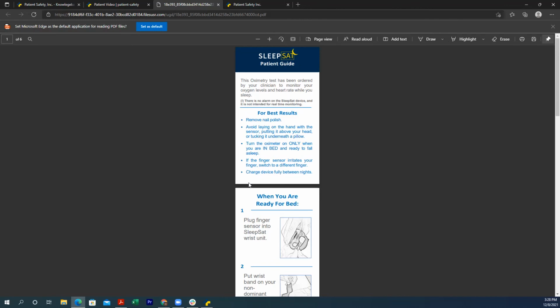So those are the two most common. Again, the fast titration where you're trying multiple settings over a series of nights in a short time period, or subjectively titrating, getting a baseline to set kind of a standard, and then doing titration as needed from that point.